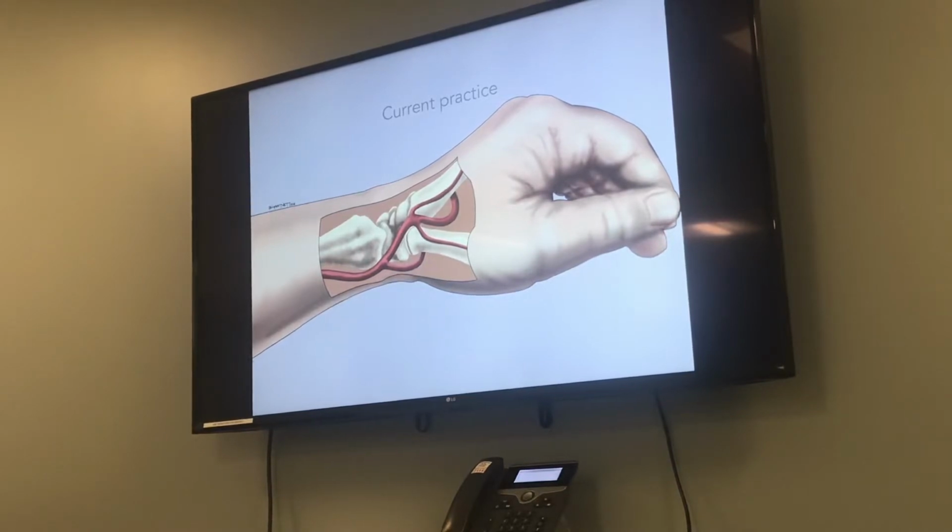So often these patients will not even leave radiology with the band inflated. It'll be completely deflated by the time they even go to peri-procedural care. And it's because, if you think about it, your snuff box, there's a bone underneath that you can feel the artery, it's easy to get to it, and it's easy to compress it. And it's also safer. The number of vessels that occlude or bleed in the snuff box is extremely low.